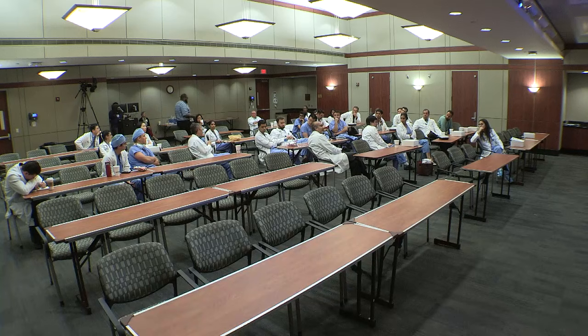So when you do a coronary CTA, we can go down to 70 kV, from 130 to 70 kV, and basically you're giving one quarter of the radiation. That's how we were able to go down to less than 1 millisievert. The calcium score, as it's standardized right now, we have to do at 120 kV. So even with the flash mode, we're still getting 1.5 to 2 millisievert of radiation, which, by the way, hasn't been that well standardized compared to the regular protocol.